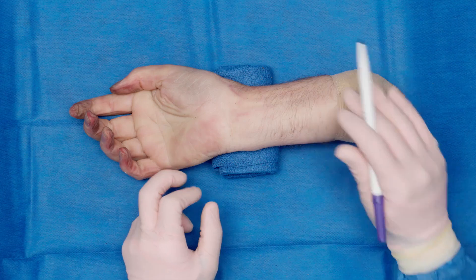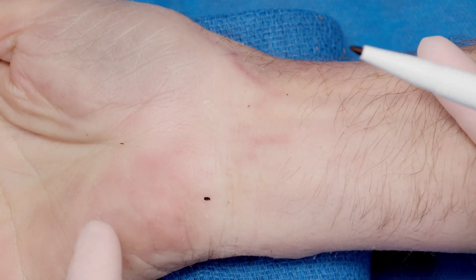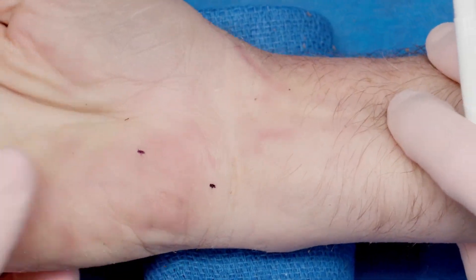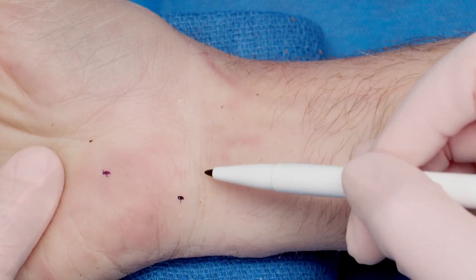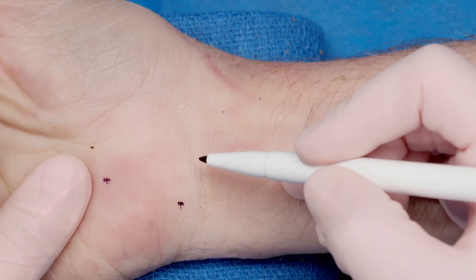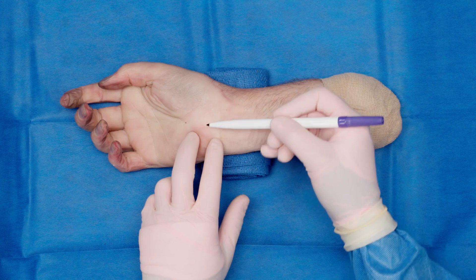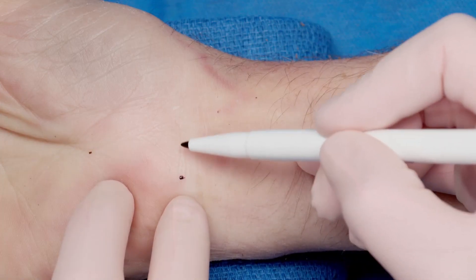I first start out by drawing out my landmarks. What you want to find is the pisiform, so I'll make a small dot there, and the hook of the hamate, because you do want to hug that. You can look for their creases — to make this as cosmetically pleasing as possible, I try to use their natural creases, which are sometimes here and sometimes closer to the palm. For this technique, you do want to stay on the hook of the hamate. You can make your incision slightly more radial, but you need to make sure you hug that hook to watch out for any aberrant branches.